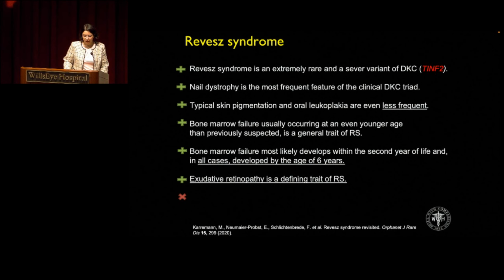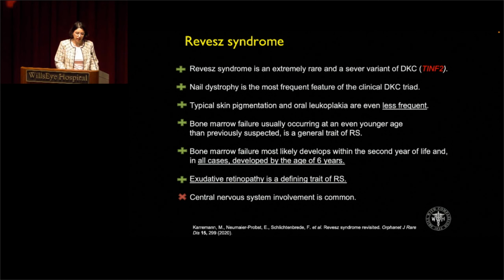And they have retinal findings as well. The only thing that's different with our case, they usually have central nervous system involvement, but our patient has no central nervous system involvement after follow-up. So I was wondering if we can call this patient just having Revesz syndrome or not.